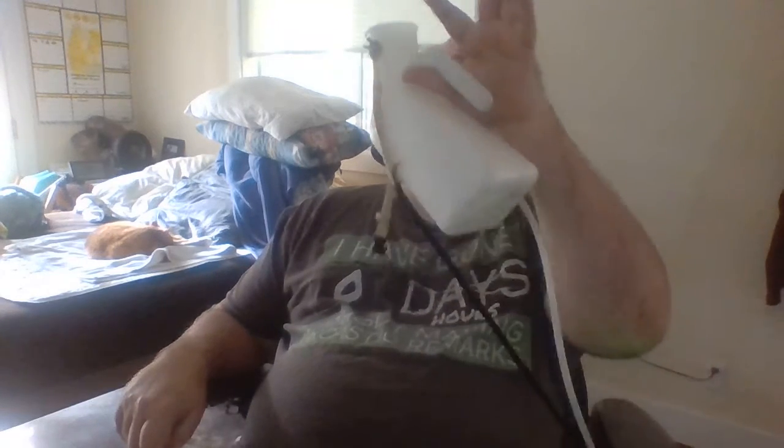A typical cripple. So, I want to show you something. This is a urinal with the tube down at the bottom here and some attachment points up here with a strap that goes around your waist and it hooks directly up to your appendage. And what that has done for me is created a situation where I don't need to constantly grab one of these every hour, 2 hours, whatever.